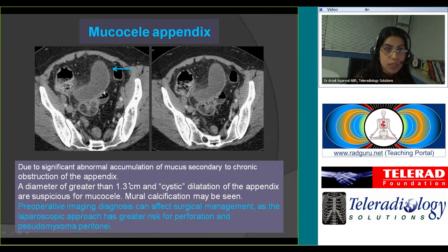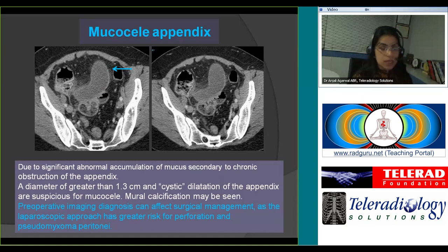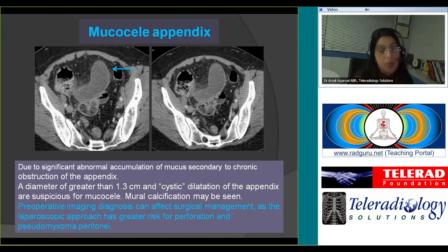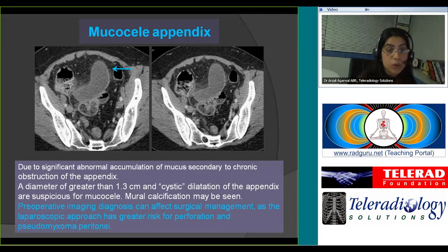Mucocele of the appendix can be diagnosed when you see an appendix greater than 1.3 centimeters demonstrating cystic dilatation. You may or may not see mural calcification. It is usually due to significant accumulation of mucus in a chronically obstructed appendix. Preoperative imaging diagnosis is important as it affects surgical management — an open surgical approach is preferred, as the laparoscopic approach has a greater risk of perforation and can result in pseudomyxoma peritonei if not adequately resected.